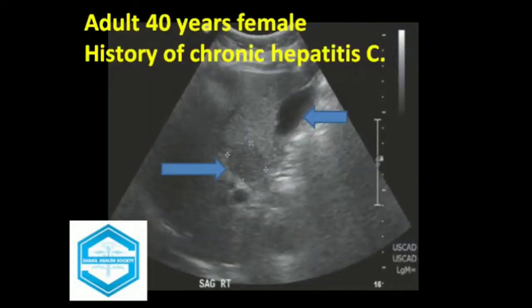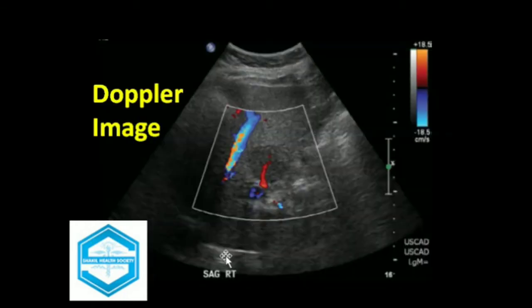This image belongs to a female patient of 40 years age who has a history of chronic hepatitis C. In this image, we can appreciate a relatively hyperechoic solid mass. This is the GB. Applying the color Doppler, the space-occupying lesion or hyperechoic solid mass shows central blood flow.